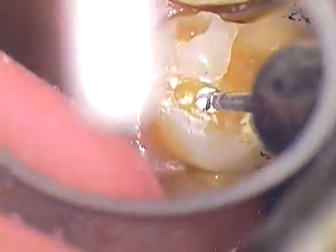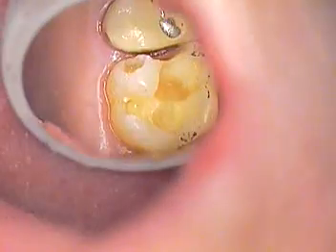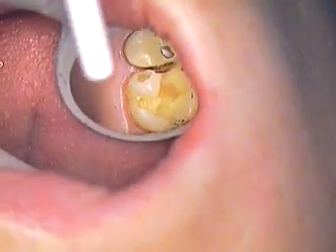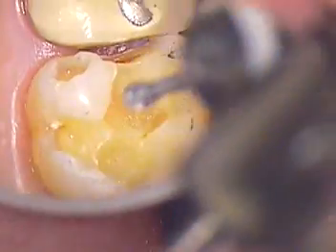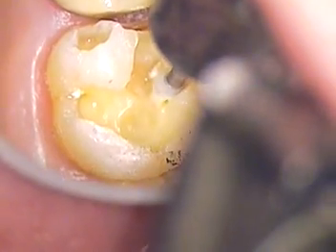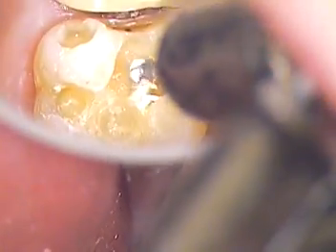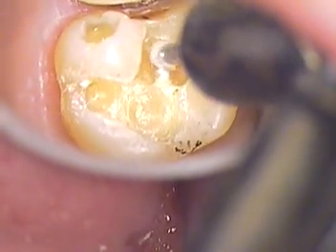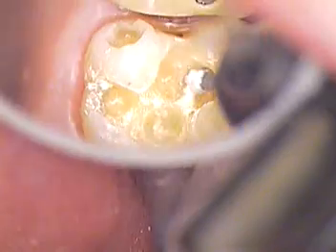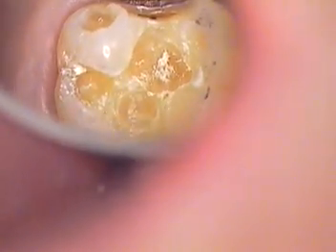Rinse that thoroughly. And just gentle air now. Air again. Now I'm going to go around the area — we're going to surround or corral this area of decay.